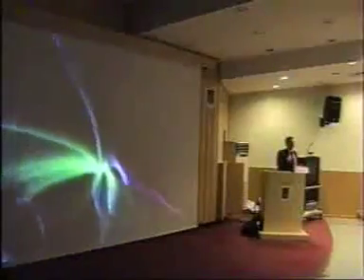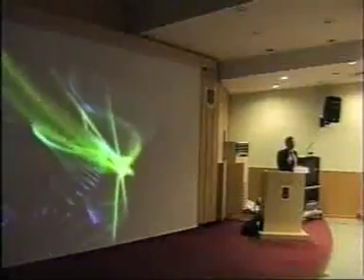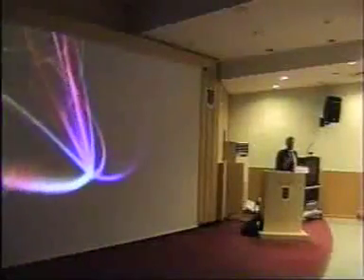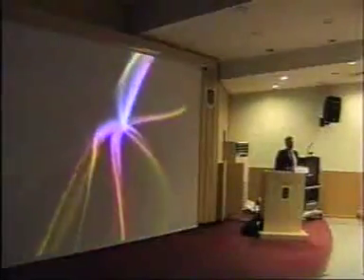So do the first few transperitoneally, make it a step, explore the kidney that way, and then try the retroperitoneal route. The best way to do it, actually, is with a surgeon that's already doing it that way, and experience with him. So I think you should pool your cases. If you're in a unit with 5 surgeons, and you decide that you want somebody to do retroperitoneal or laparoscopic nephrectomy, then other guys shouldn't be taking them out open. Okay? They should be giving you their patients, or you should be going to their operating room and operating with them, doing it laparoscopically. That's where you learn together, you increase your experience, and support each other's development.